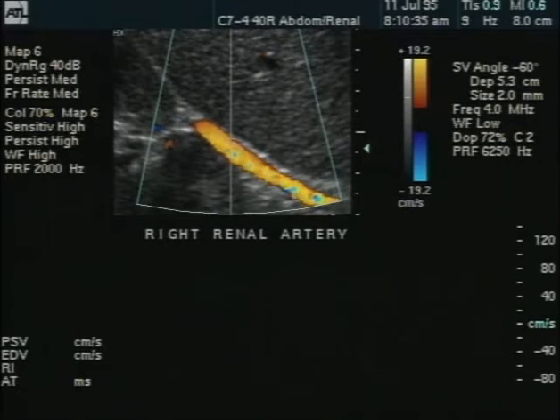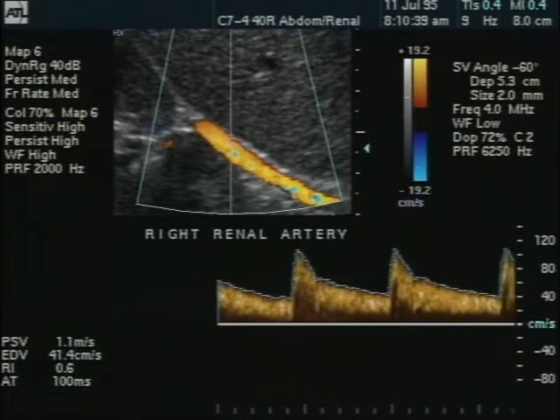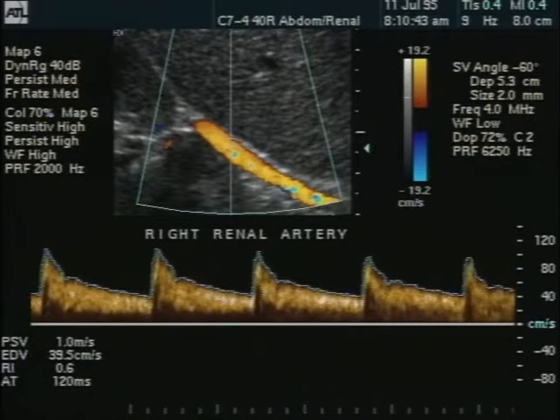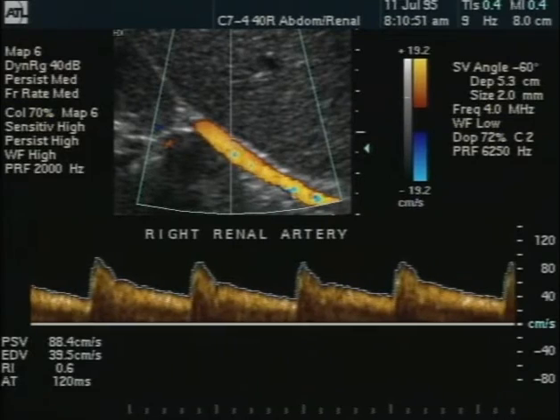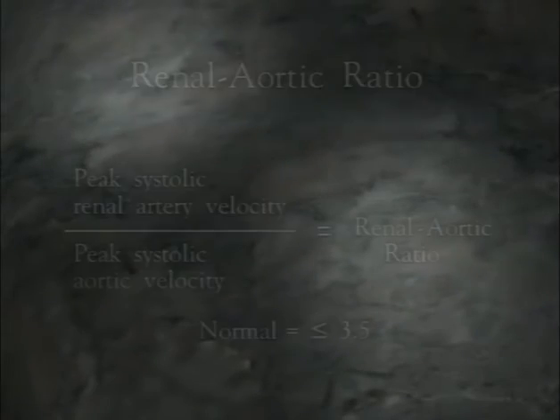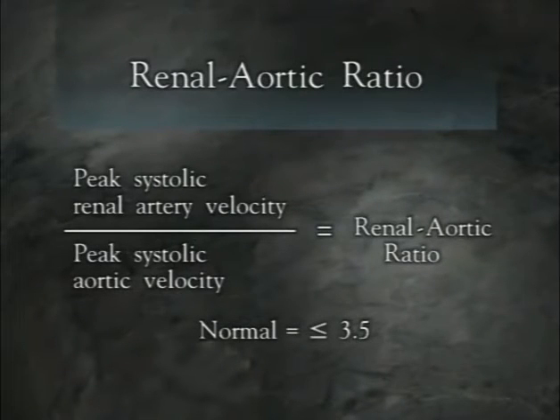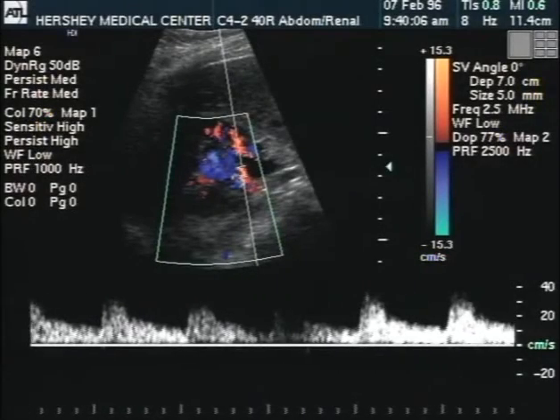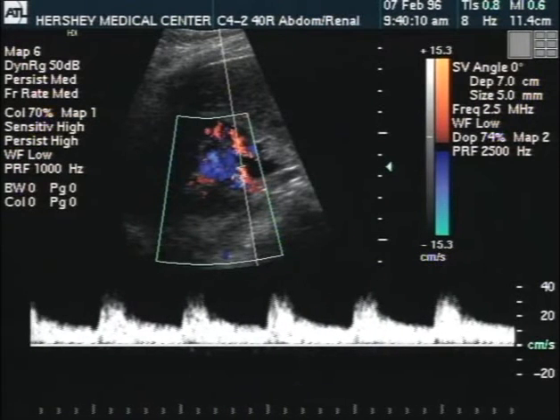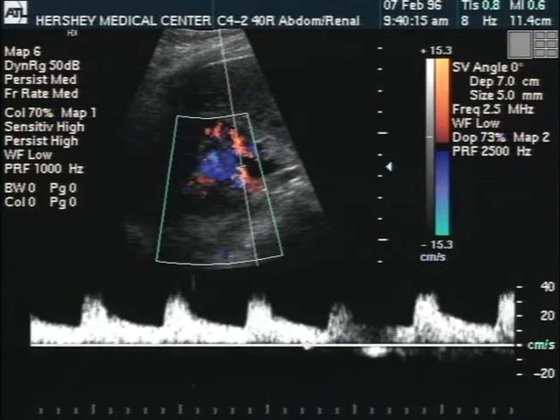The renal arterial and venous systems are the next major visceral circulatory systems to be considered. The kidneys, like the brain, liver, and spleen, demand constant blood flow to meet their metabolic demands. Therefore, the Doppler spectral waveforms from the normal renal artery demonstrate forward diastolic flow, similar to the waveforms from the celiac, hepatic, and splenic arteries. The angle-corrected peak systolic renal artery velocity may be slightly higher than the peak systolic aortic velocity, but a ratio of these peak velocities will be less than 3.5 in the absence of flow-reducing renal artery stenosis. These low resistance waveforms seen in the main renal arteries are also documented throughout the intersegmental arteries of the medulla and arcuate arteries of the cortex of the normal kidney.